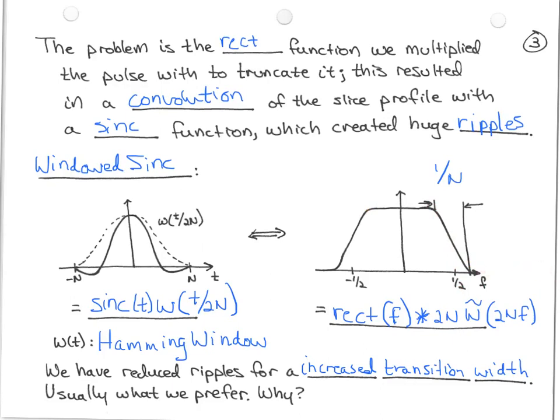If you remember that when we do slice selective excitation, we're not going to, after that, do any Z encoding along this dimension, right? So our imaging readout is not going to resolve along this dimension. So everything that is excited along here is just going to alias into the slice. And it's better to have that aliasing happen from spatial locations that are right next to the slice than it is from locations that are far away. I hope that makes sense.